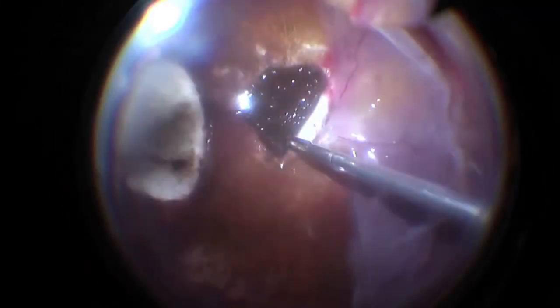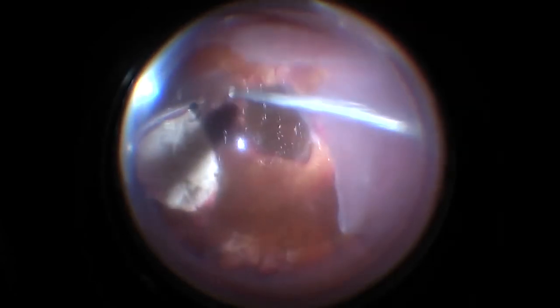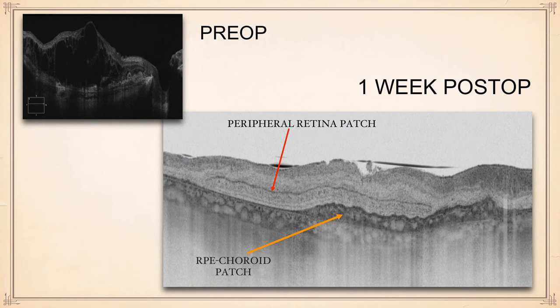So I performed the usual choroidal patch under the fovea, harvested from the mid-periphery. And then I decided to harvest a peripheral patch of retina as well. The literature tells us something. It's been reported that from the very periphery, close to the ora serrata, there are multipotent cells that may become photoreceptors, for example, after PVR, as an inflammatory response. So I decided to harvest the peripheral retina.